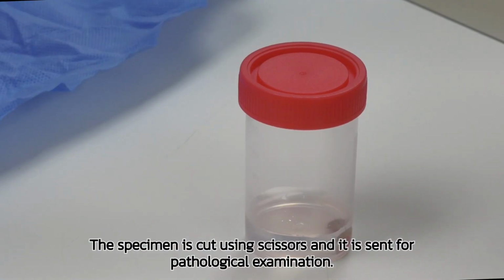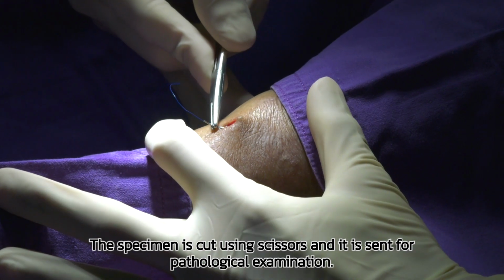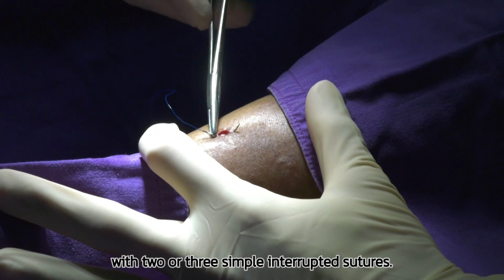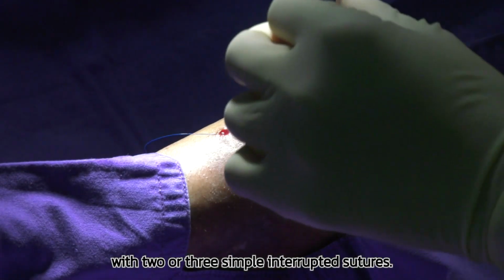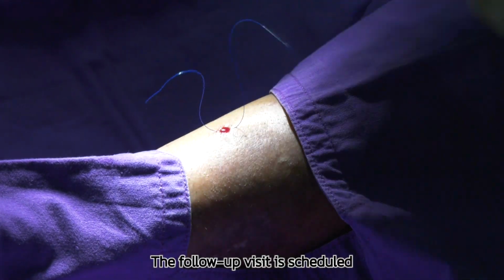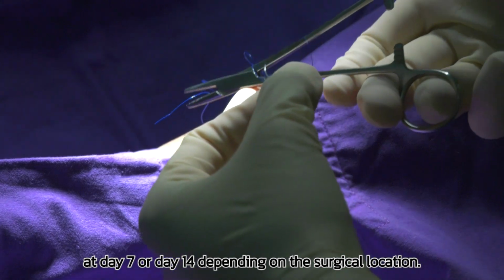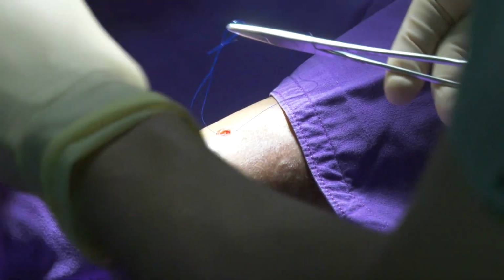The specimen is cut using scissors and it is sent for pathological examination. The wound is closed with 2 or 3 simple interrupted sutures. The follow-up visit is scheduled at day 7 or day 14, depending on the surgical location.